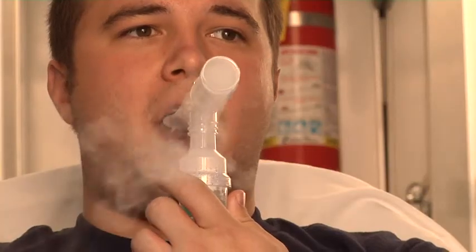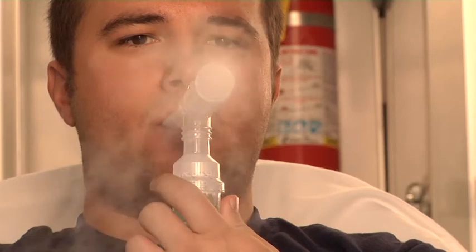Many people who are using nebulizers like this have experience using them. If not, we'll ask the patient to seal their lips around the device and just breathe normally. When using a bronchodilator such as albuterol, some early effects include loosening of secretions and production of extra sputum or phlegm from the lungs. People may become coughing, start to become tachycardic from the cardiac effects of the albuterol, and sometimes become somewhat nauseous from the albuterol itself.